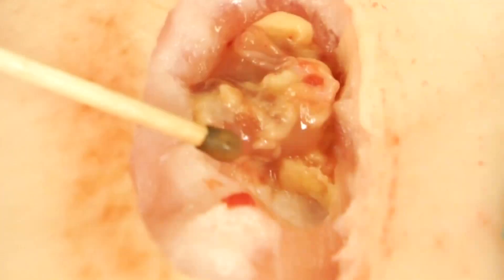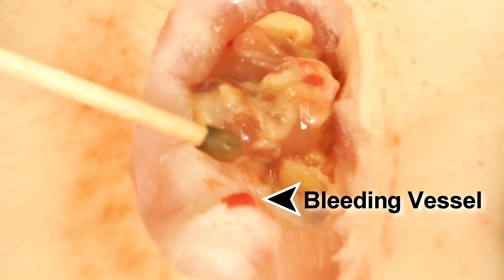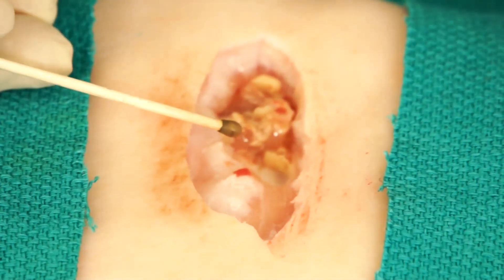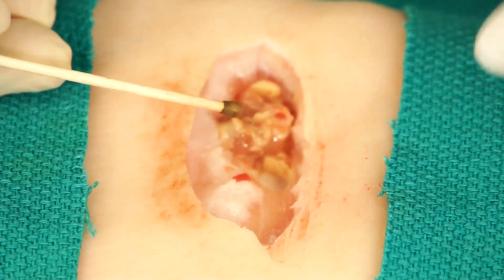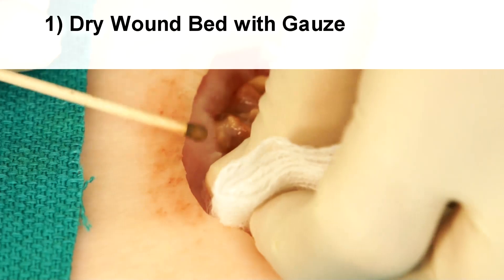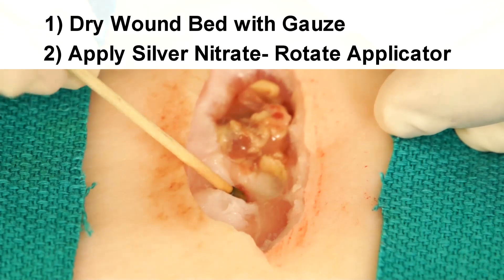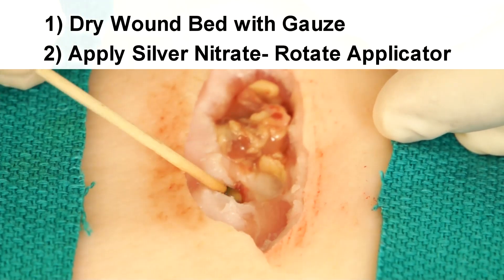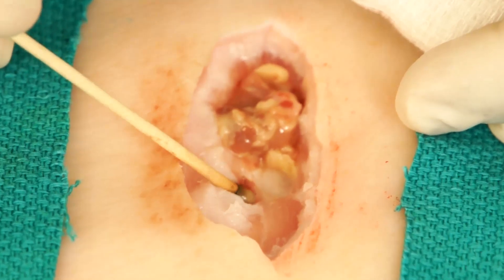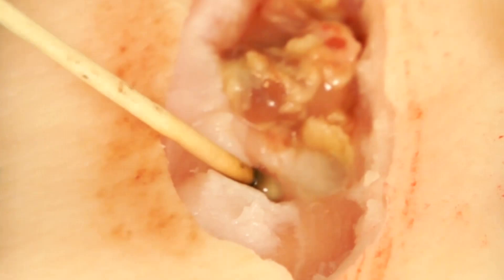In this wound model, you can see that at the depth of the wound there is an area of red, which demonstrates a vessel that is oozing. When silver nitrate is applied, it works best when the wound is maximally dry. Initially, you will want to use a gauze and apply pressure to dry the wound bed. Once this has been achieved, remove the gauze and quickly apply the silver nitrate to the area of maximum bleeding. The silver nitrate stick should be rotated gently, and as you rotate it, the silver nitrate will be removed from the tip of the applicator.